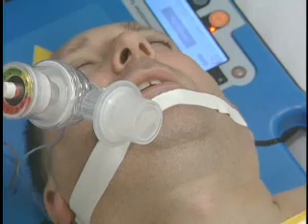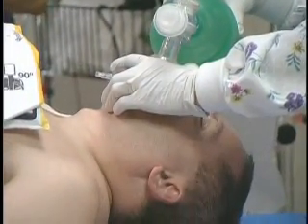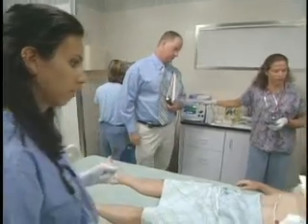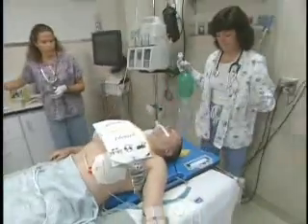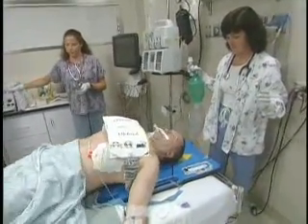The auto pulse is on continuous, we have pulse, we have capnography and end-tidal CO2. Okay, we're ready — clear, all clear. Shock at 200 joules.